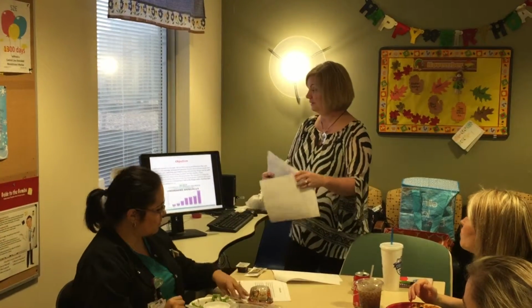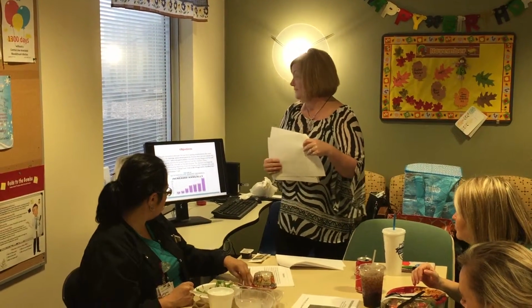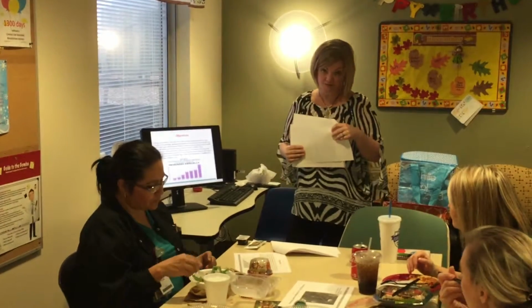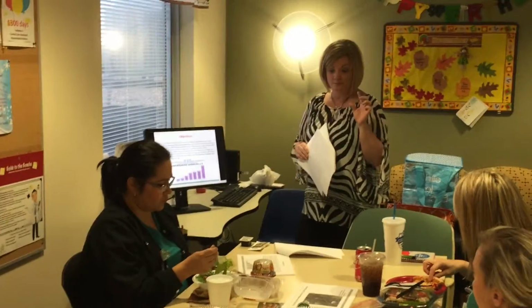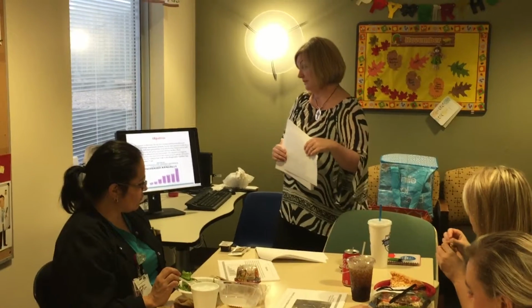So I thought of 3 areas to focus on that are a little bit different for this patient group. The nursing assessment process is different because these patients usually do not have a palpable pulse, and you also cannot use the pulse ox on the end of the finger that we normally are used to using. There is a huge infection risk with these patients as well. The device is implanted into the chest, and there is a line that comes out of the abdomen called the drive line that has very specific dressing requirements. So if they get an infection, it can be really critical to them.